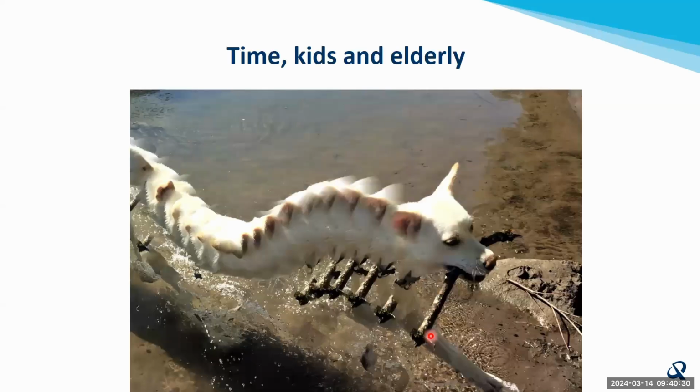Now, I just wanted to spend the last part of this talk on an artifact that we've noticed a little bit on EOS that everyone can look out for. So it's worth mentioning. This is from a subreddit on panoramic photo fails, but I'm sure if anyone's tried to take a panoramic photo with a moving object in it, you can come up with some pretty strange artifacts. And EOS is sort of like a panoramic acquisition, sort of from top to bottom, and you can wind up with some problems because of that.